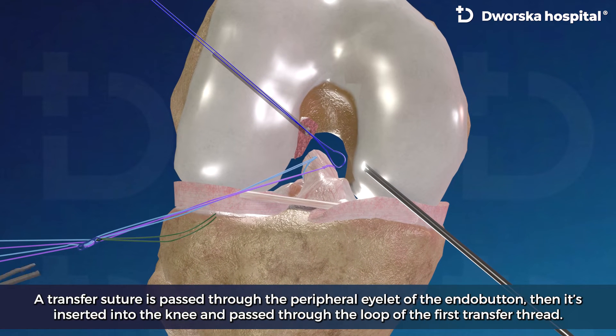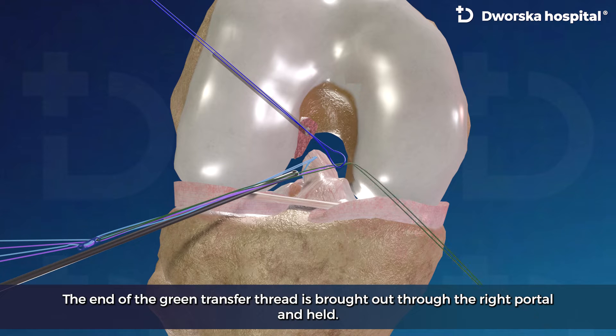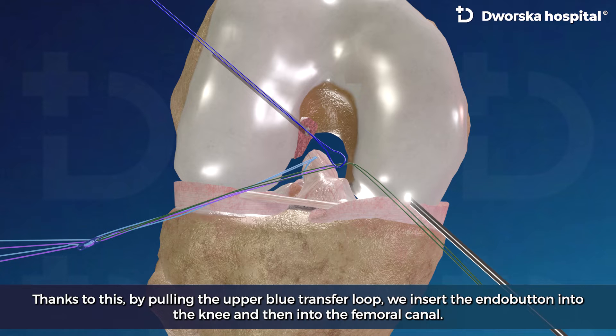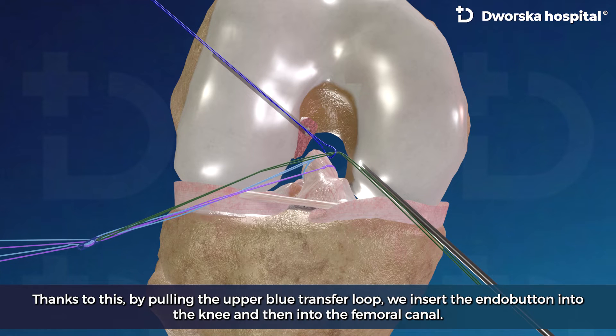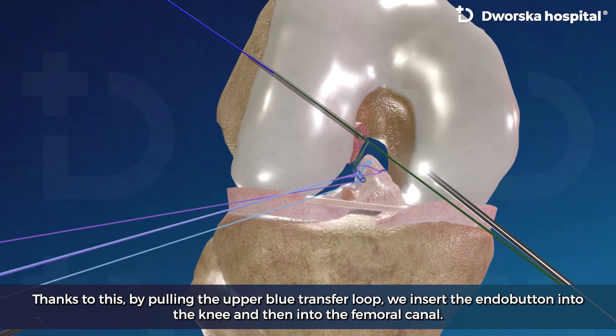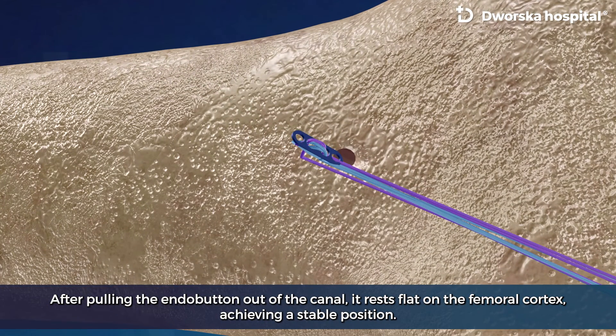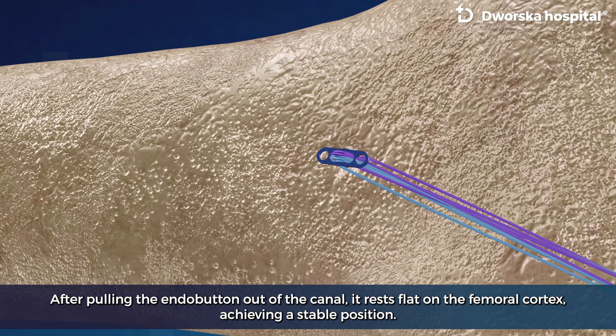The endobutton is inserted into the knee and passed through the loop of the first transfer thread. The end of the green transfer thread is brought out through the right portal and held. By pulling the upper transfer loop, we insert the endobutton into the knee and then into the femoral canal. After pulling the endobutton out of the canal, it rests flat on the femoral cortex, achieving a stable position.